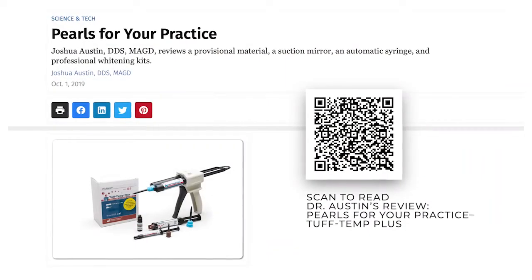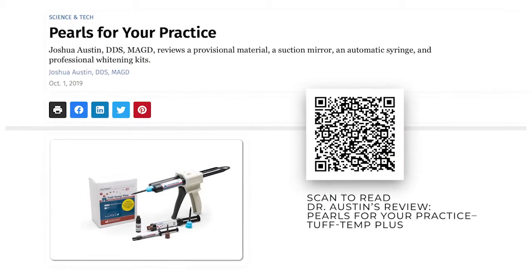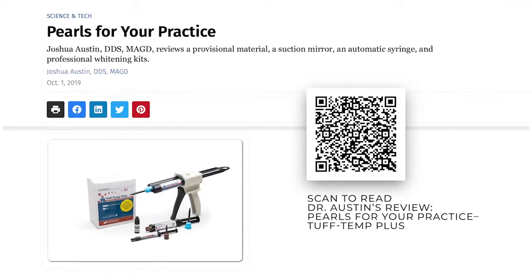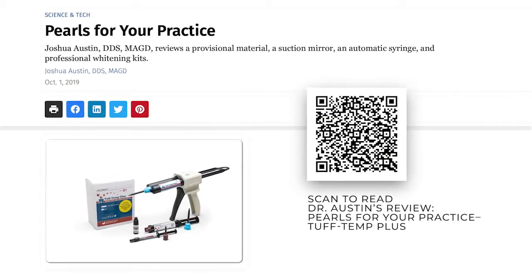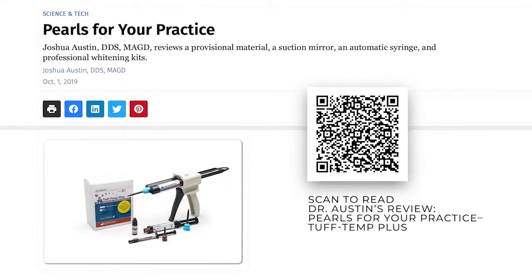So today we're going to make a three-unit FPD provisional, and we're going to walk through the process of that, how I do it, what burrs do I use to trim, where do I use discs, all that kind of stuff, and then walking through the repair process should we need to, and then glazing it if we want to take it to the next level. So let's go take a look.